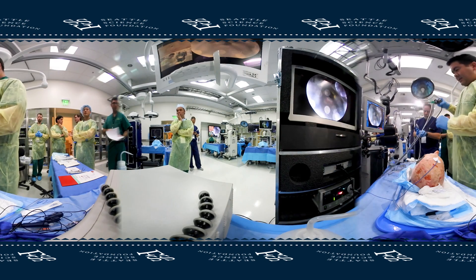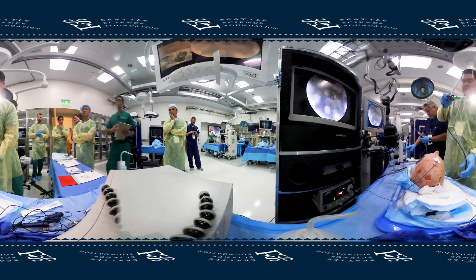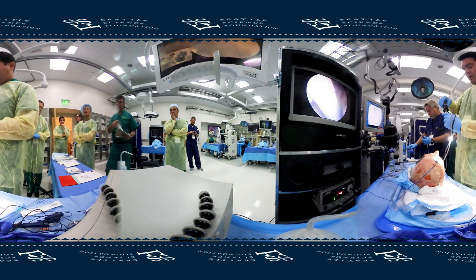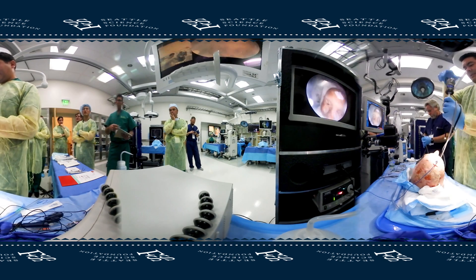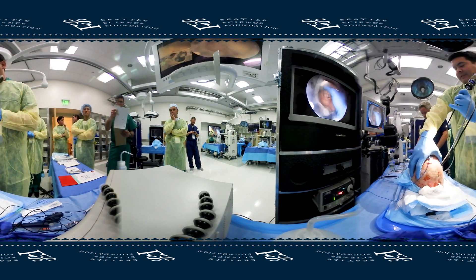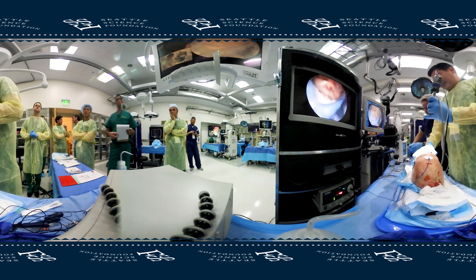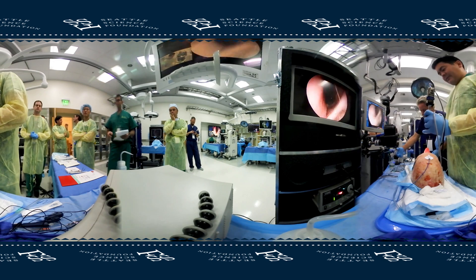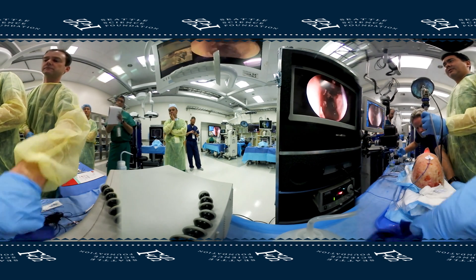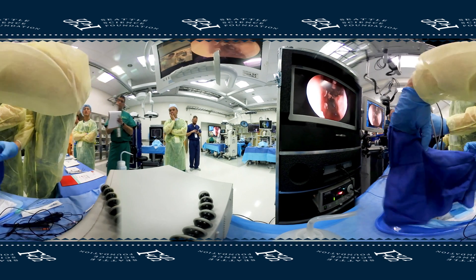Endoscopic medial maxillectomy has, in a lot of ways, supplanted open approaches like lateral rhinotomy. It provides very, very good exposure if you have a tumor in the maxillary sinus. It's also very useful for folks that have condemned mucosa or people with CF.